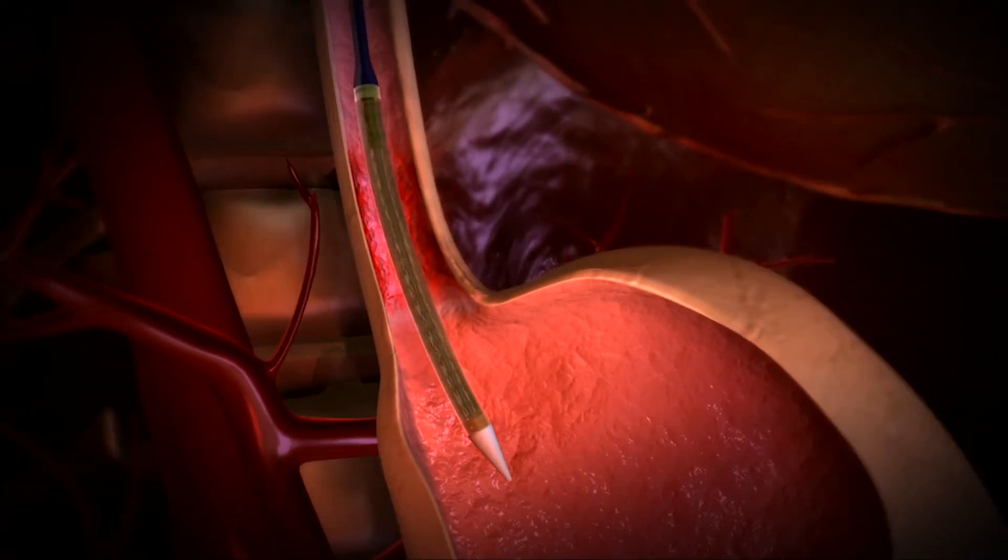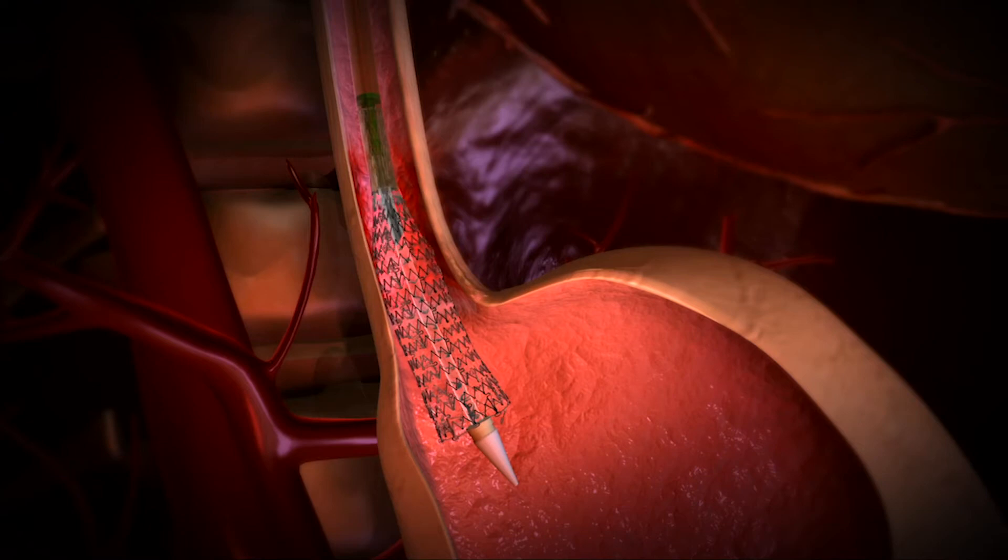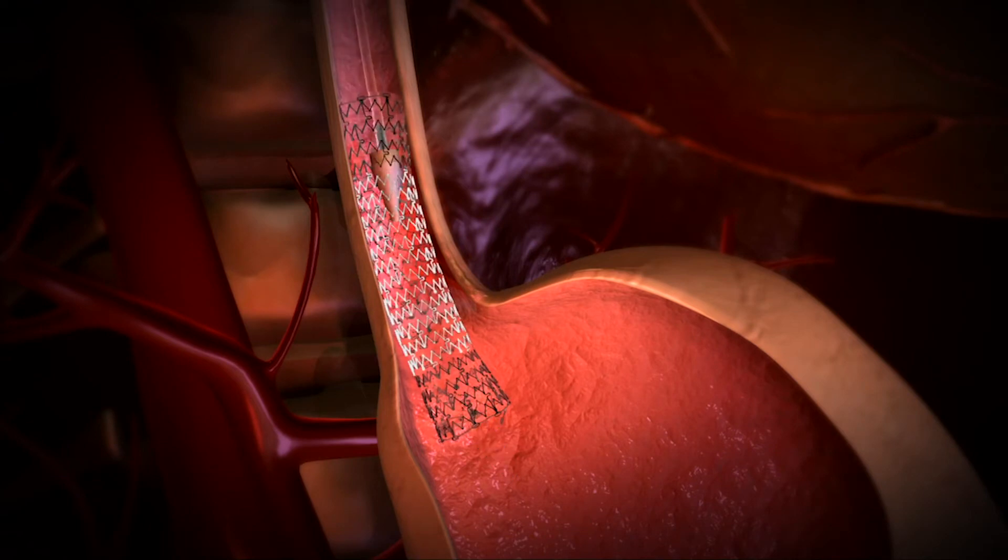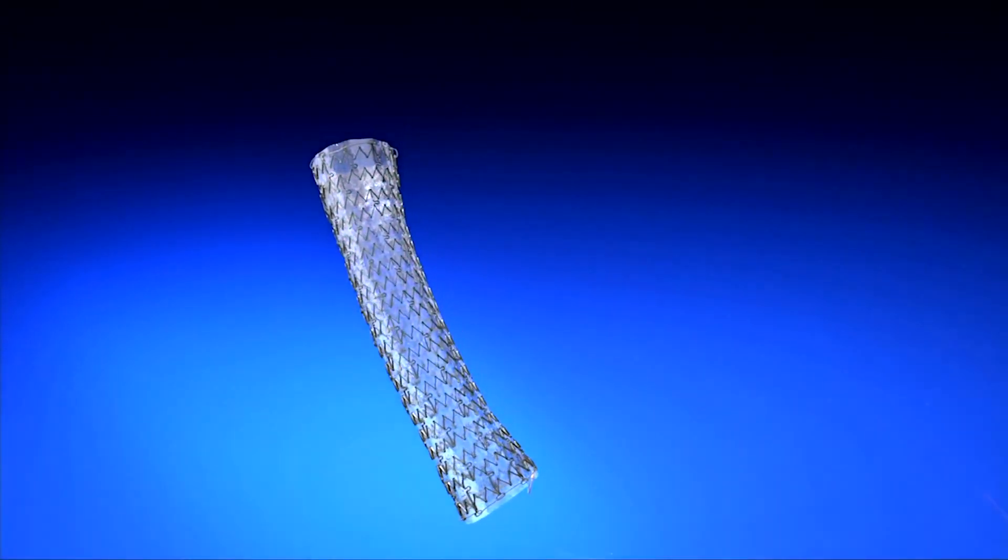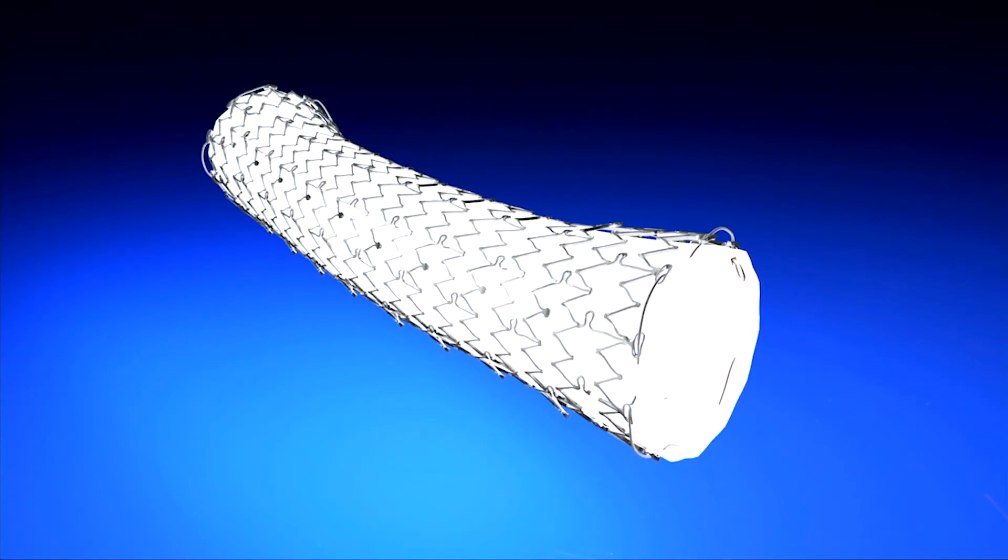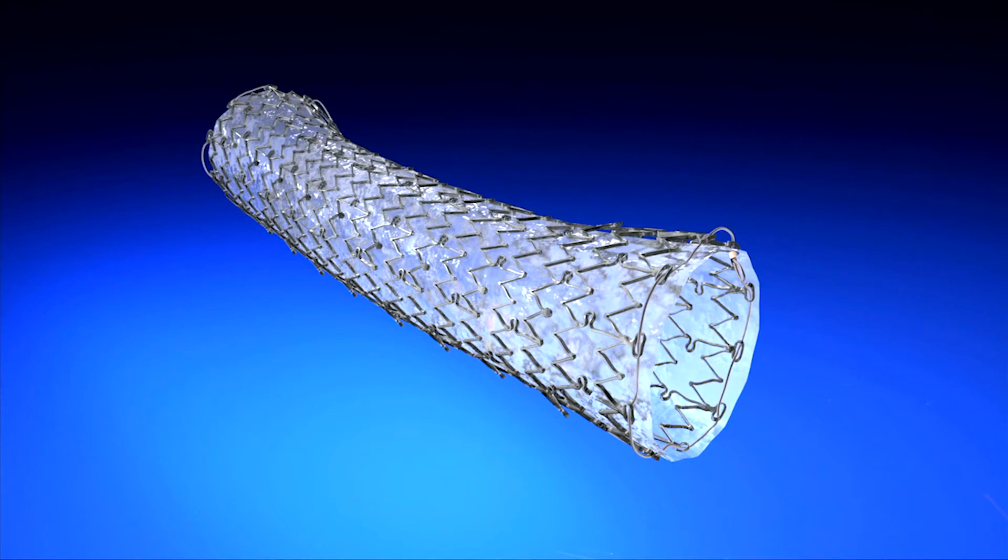The Endomax is designed to dilate a stricture while reducing tissue irritation and damage to healthy esophageal mucosa. The Endomax is fully covered in silicone which helps provide flexibility and durability of the stent.